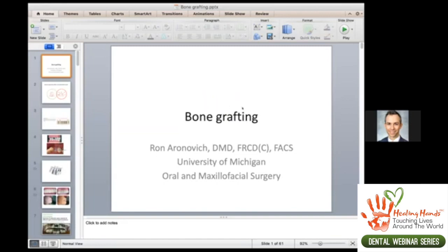When there's severe resorption and the mobile mucosa is near the grafting, is the grafting correcting this condition? So that's a good question. I would say bone is the most important thing when it comes to being able to place an implant and for the aesthetics.